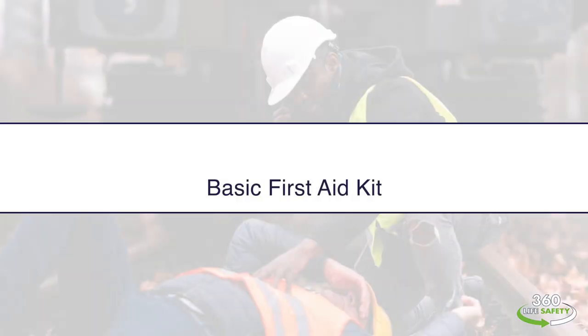Hi everyone, Rachel from 360 Life Safety here to talk to you about our wonderful compact 92 piece First Aid Kit.